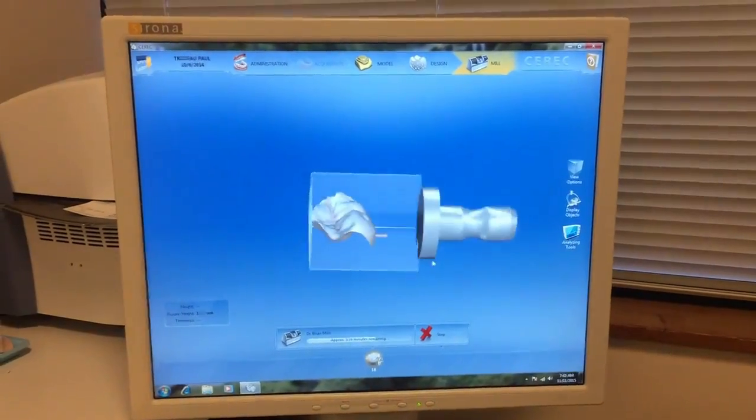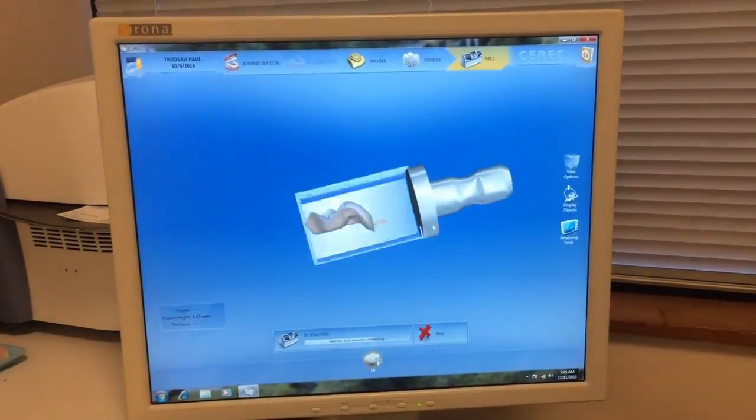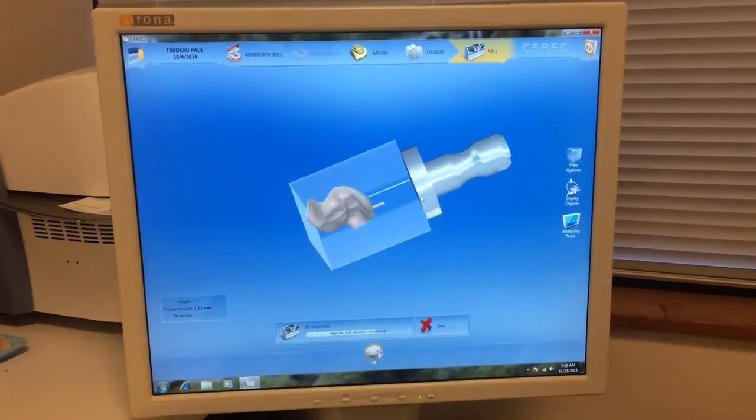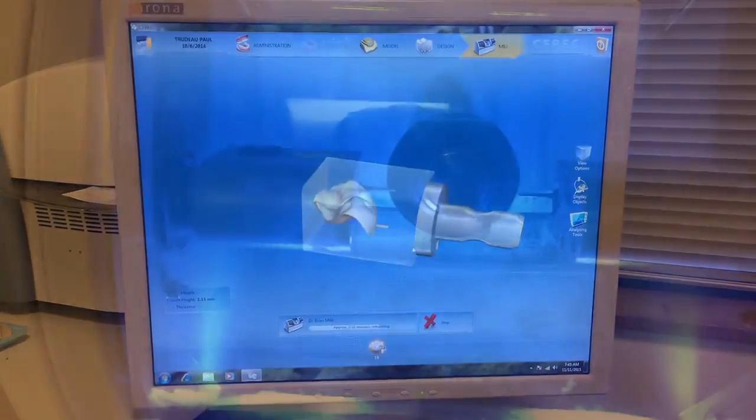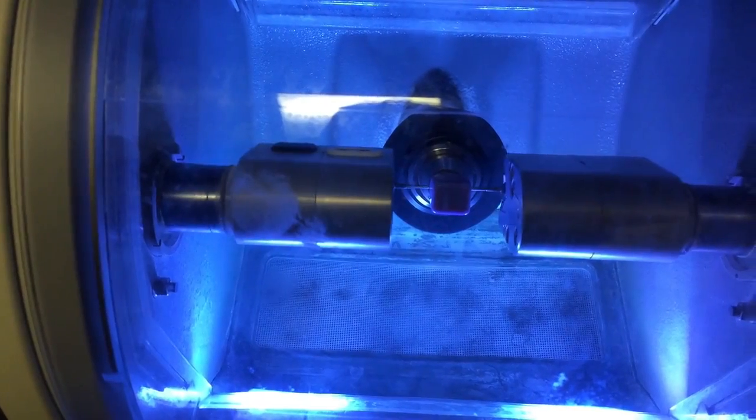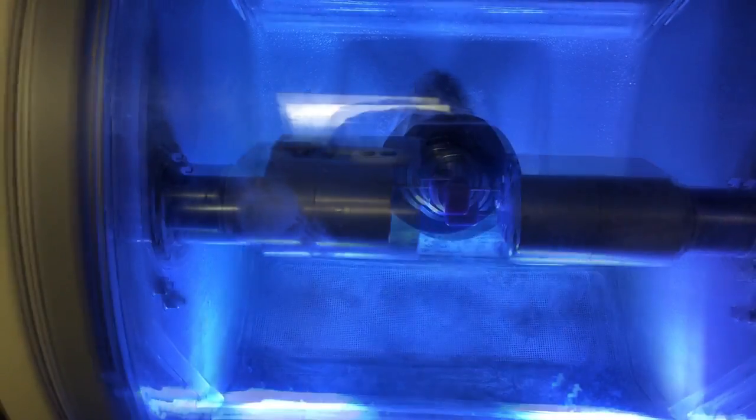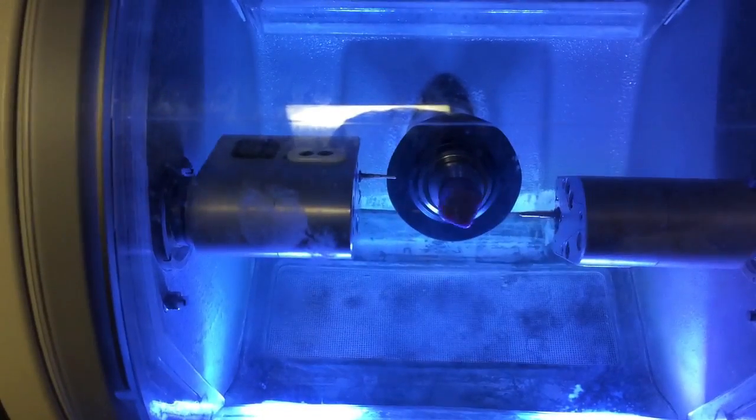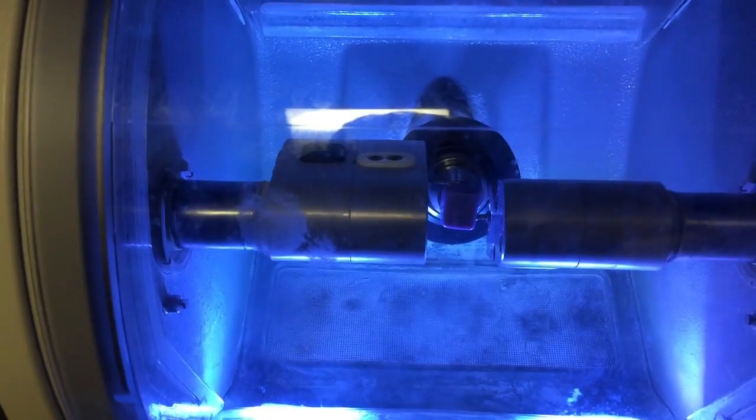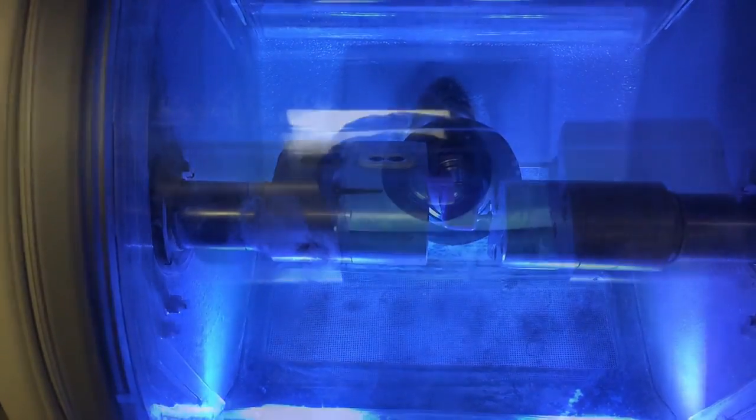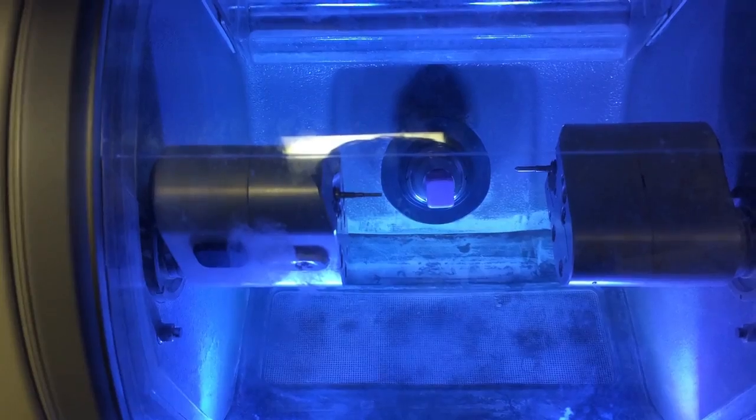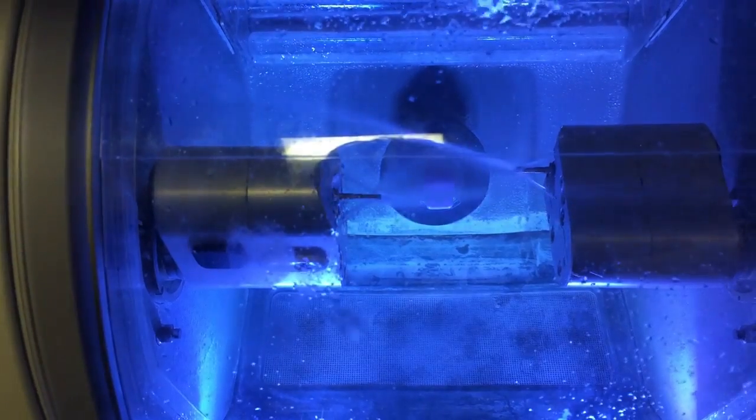The crown is milled from a solid block of engineered porcelain which is quite strong. The milling machine precisely measures and mills the crown from the monolithic porcelain block.